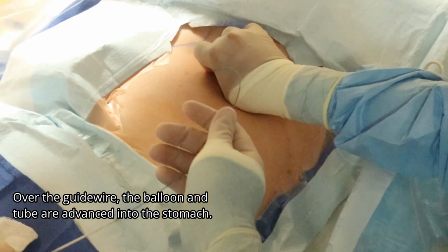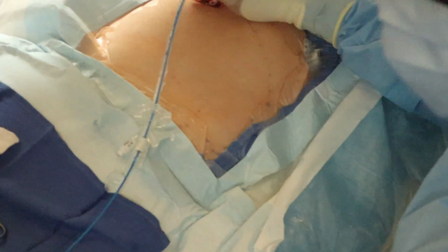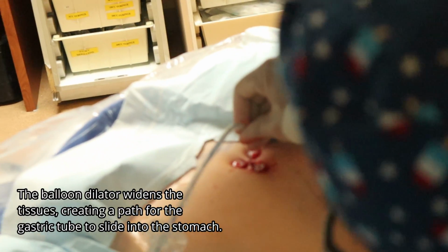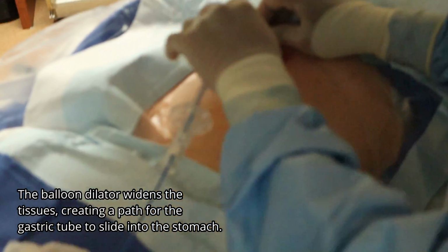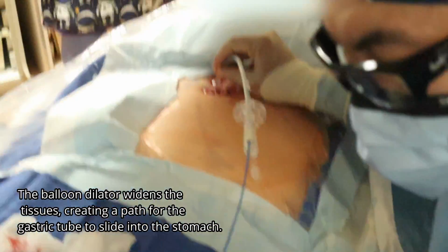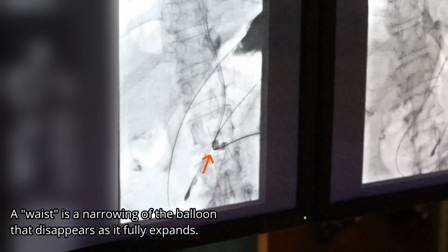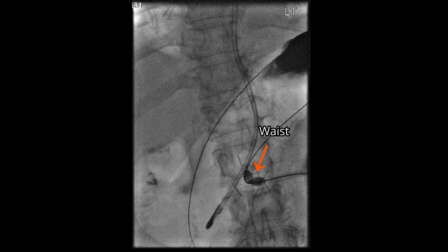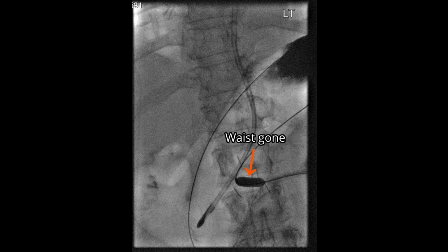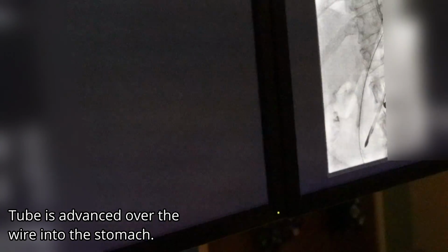I'm going to load it over the wire. Once the balloon is loaded, we'll bring the G-tube all the way up close to the trail edge of the balloon. So what I'm going to do is bring this balloon all the way up to the trail edge of the tube. Push this in. We're going to insufflate. Insufflating. And we're going to do this under fluoro here. And then Mahmoud, you're going to insufflate the stomach. Insufflating. Push all the way back, and then we're going to slowly push this tube over.